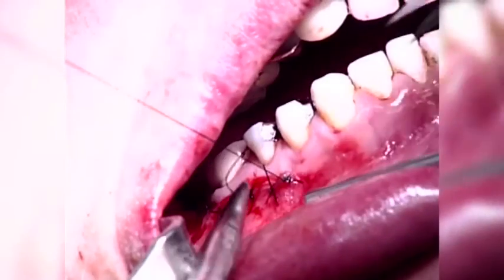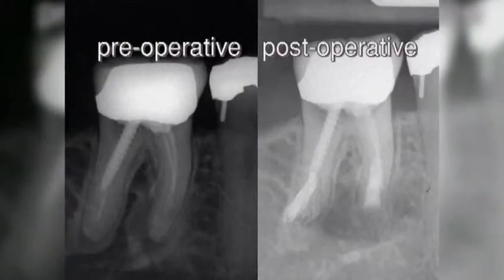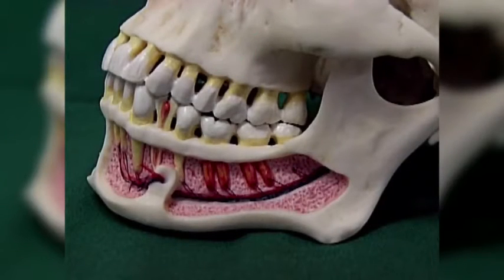The hand instruments are used to condense the material into the cavity. Control of the retrograde root filling. Pre- and post-operative bite-wing radiographs. Similarly, the tooth is prepared for a retrograde root canal filling.